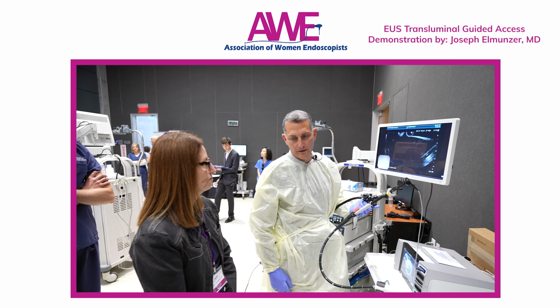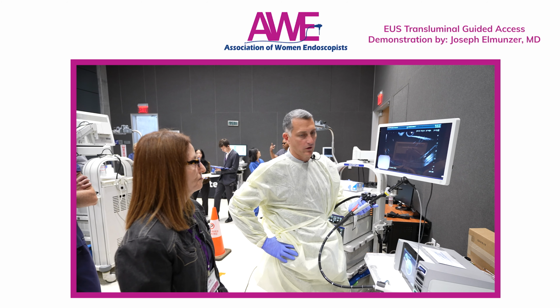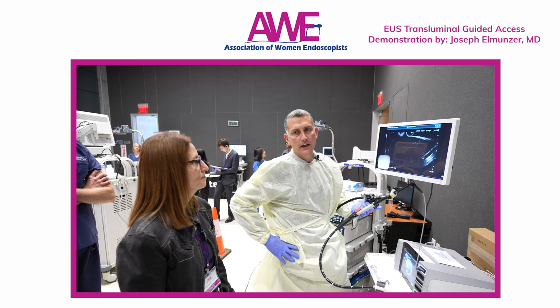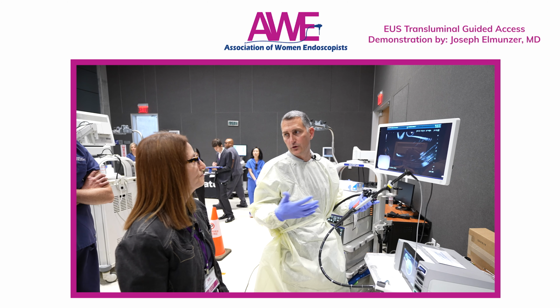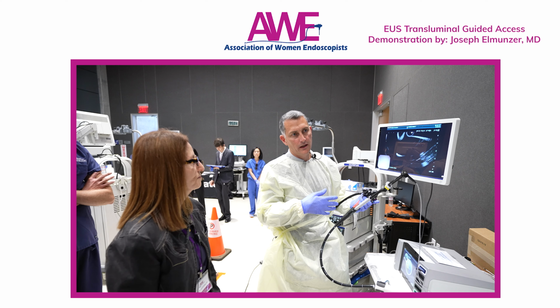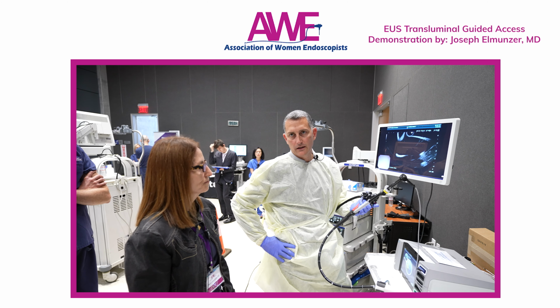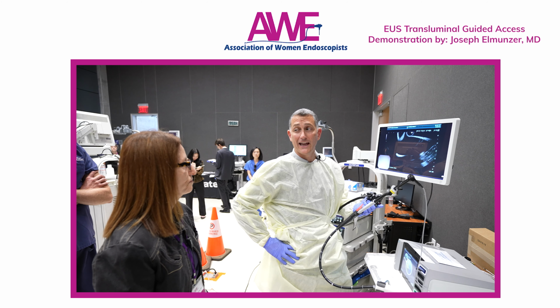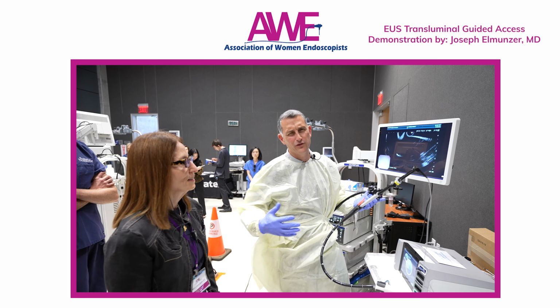But yeah, to your point, there are a lot of clinical indications that have evolved over the last few years for EUS-guided deployment of lumen-apposing metal stents. It started with pancreatic fluid collection drainage, and it's FDA approved for gallbladder drainage, but we also use it for abscesses, direct drainage of the bile duct, EUS-guided gastrojejunostomy for gastric outlet obstruction, and commonly for a procedure called EDGE to facilitate per oral ERCP in patients with Roux-en-Y gastric bypass. So those are the most common indications.